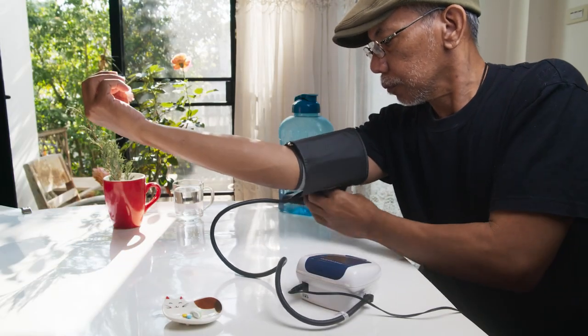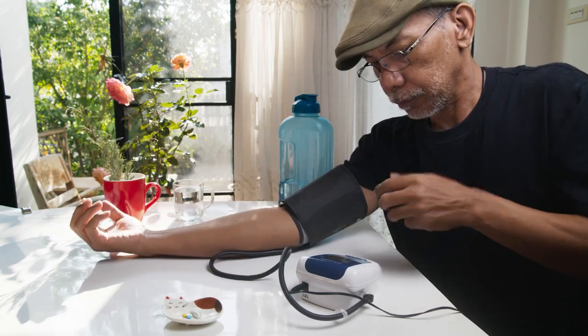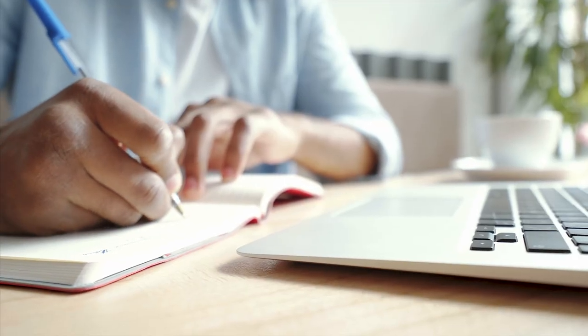Lastly, remember to take at least two or three readings about a minute apart and record them for your doctor to review.